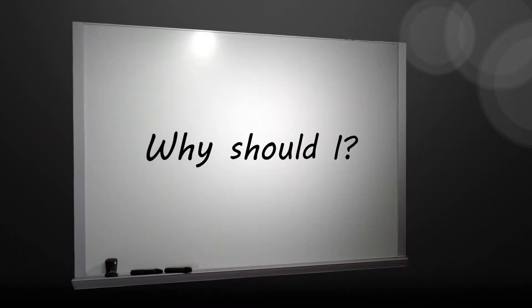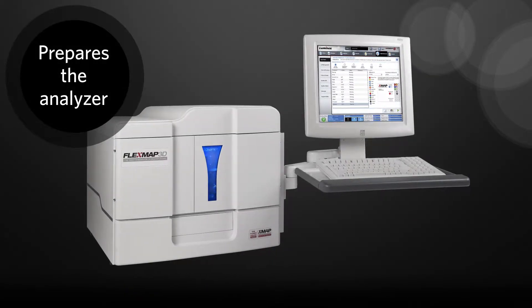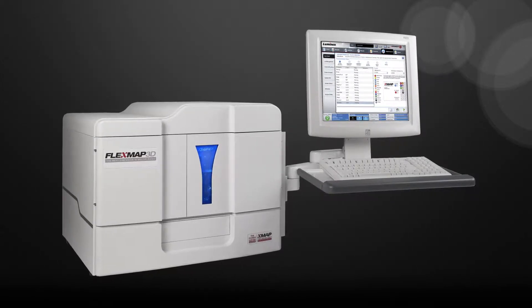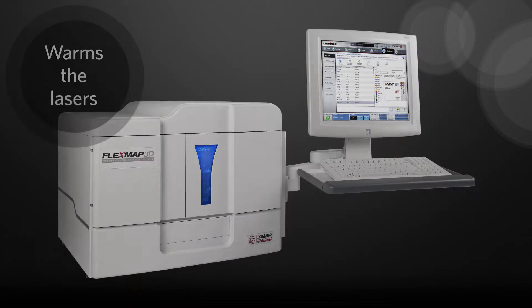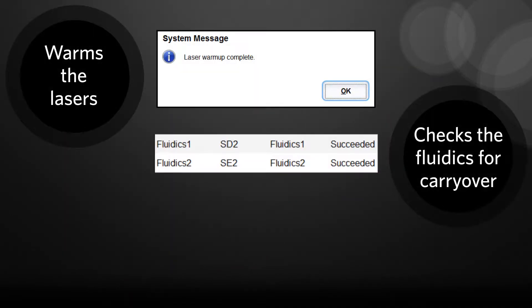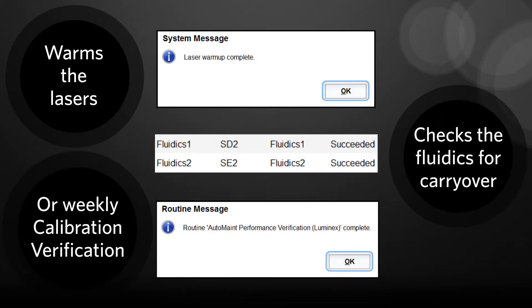Why should I run a system initialization on the FlexMap 3D? Running the system initialization prepares the instrument for use. The predefined system initialization routine will prepare the analyzer for data acquisition by warming up the system, checking the fluidics for carryover from well to well, and ensuring performance through daily verification and weekly calibration. This prevents clogs in the instrument and ensures accurate readings.